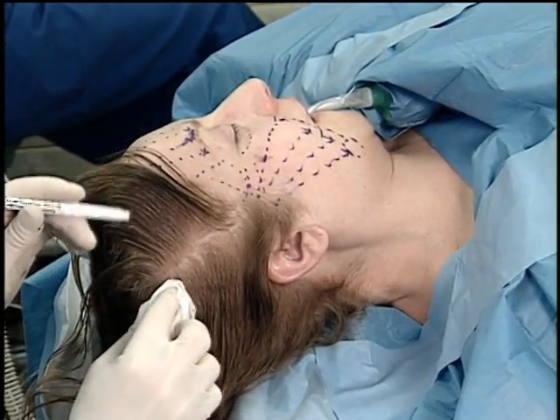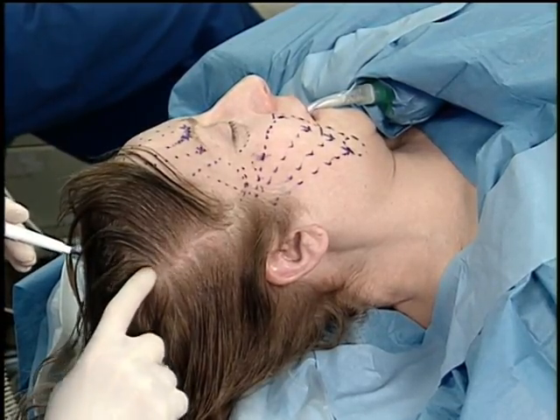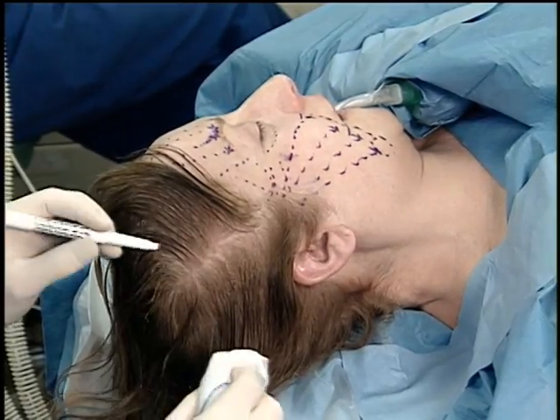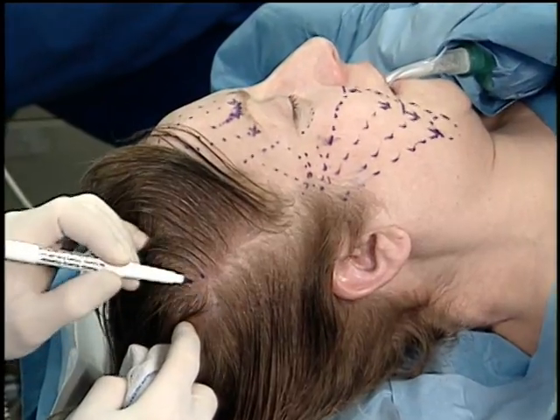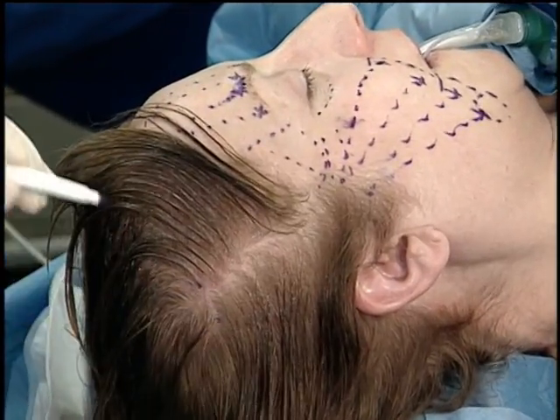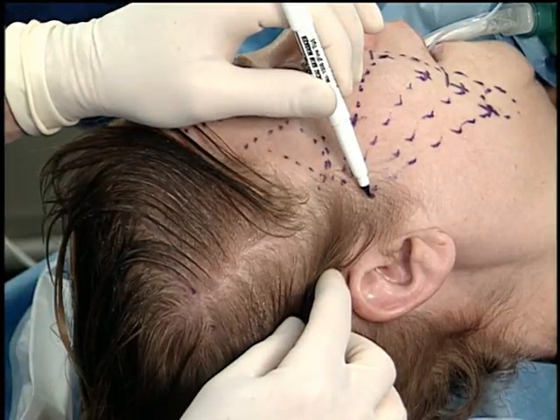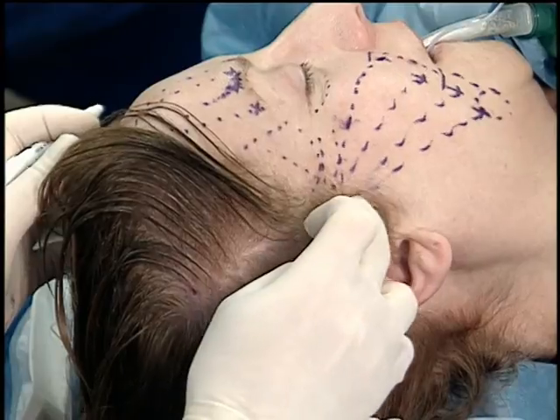So I go up into the scalp and I feel for where the parietal bone is starting to curve around, or the temporal bone is curving around to become the parietal bone, and that's where I'll enter. So I'm going to have 2 entrance points right here, about 2 inches apart, and exit points 2 inches apart, and I'm going to use a common entrance point right here. So this point is going to be lifting the face.